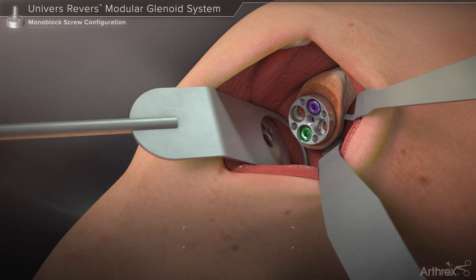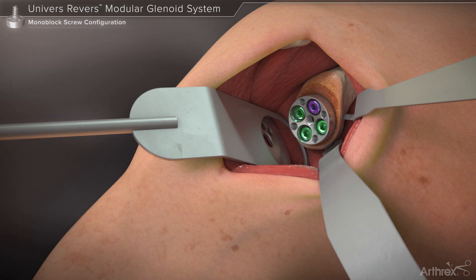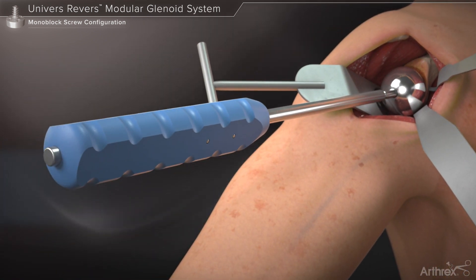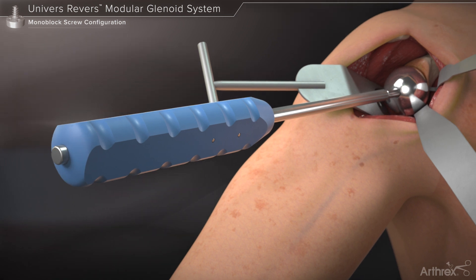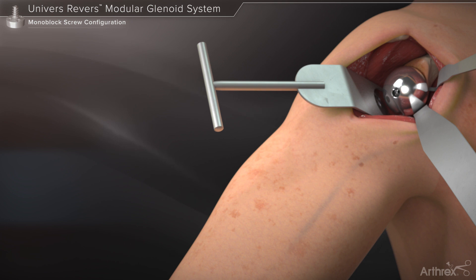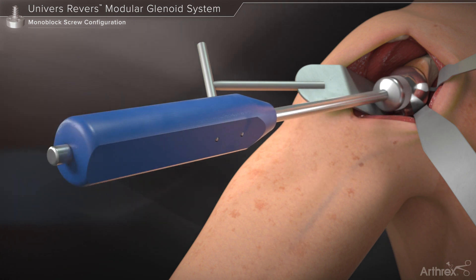The use of locking or non-locking screws and their placement within the base plate is based on surgeon preference. A glenosphere is threaded onto the glenosphere inserter and introduced over the base plate taper. Provisional seating of the taper may be achieved by pushing the glenosphere onto the base plate using the inserter handle. Once seated, the inserter is unthreaded from the glenosphere and removed. The glenosphere is then impacted onto the base plate taper using several sharp mallet blows.